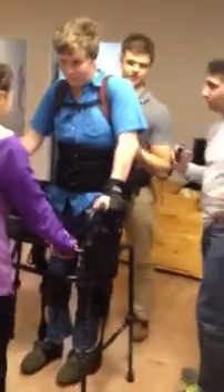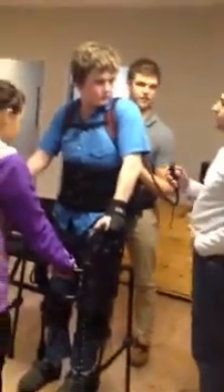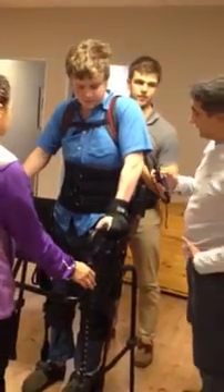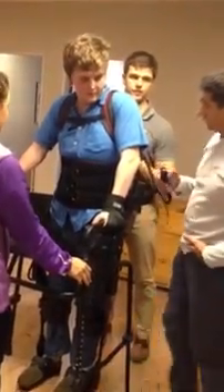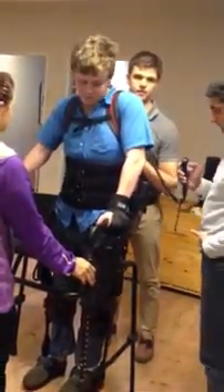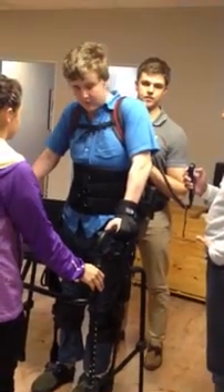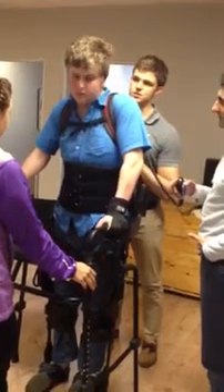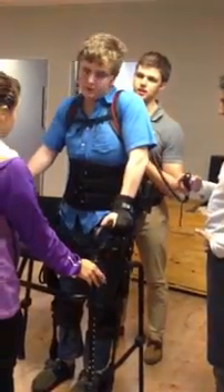Okay, so let's see if we can walk to the door. So this is what we've got you to do. We want you to transfer your weight over your left leg, then you lean forward and your right leg is going to move. First right and then left — lean to the left, your right leg is going to move forward. Step first with the right leg. So basically like a penguin.